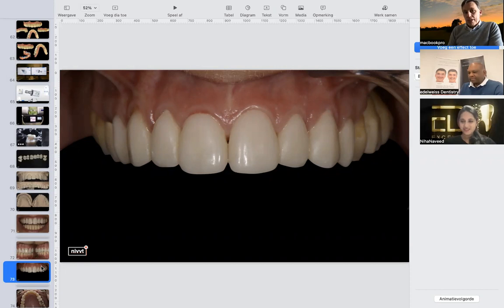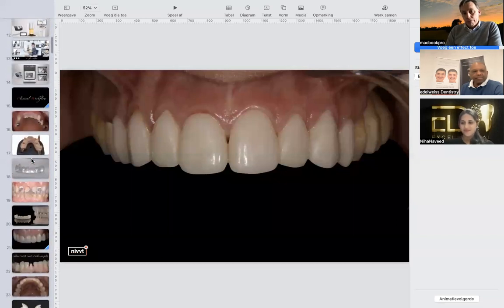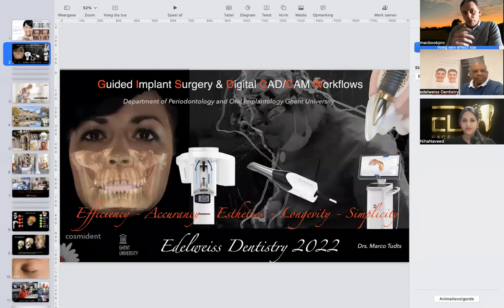Okay, with face scan, there are a few ways you can do it nowadays, but in the nearby future there will be many more companies bringing the face scan on top. The good thing about the face scan, like you see on a slide like this, is that you can put everything together.